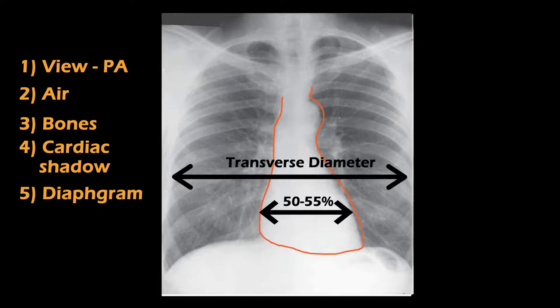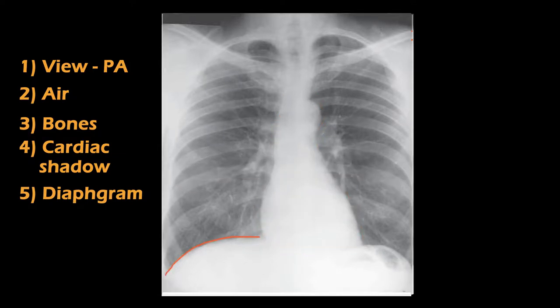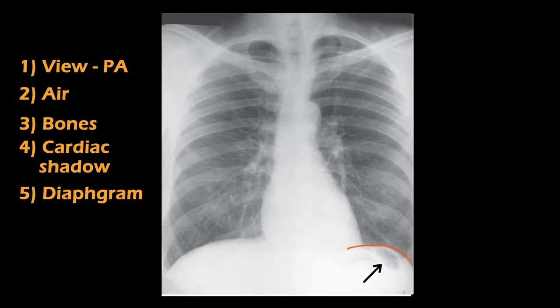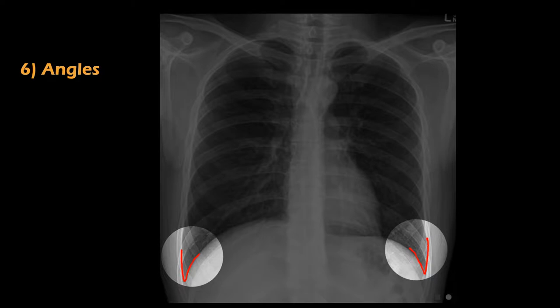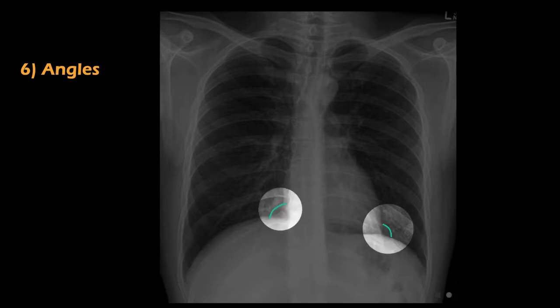D stands for diaphragm, showing the right and the left domes. The right dome of the diaphragm lies at the level of about the sixth rib anteriorly, with the shadow of the liver beneath it. The left dome shows gas in the fundus of the stomach below it. Now for the second sequence — A stands for angles. These are the two costofrenic angles; costo means ribs and phrenic refers to the diaphragm. Normally this angle is clear, sharp, and pointed, but it is obliterated in conditions like pleural effusion. These are the right and left cardiophrenic angles — the angles between the heart and the diaphragm — which are obliterated in pericardial effusion.